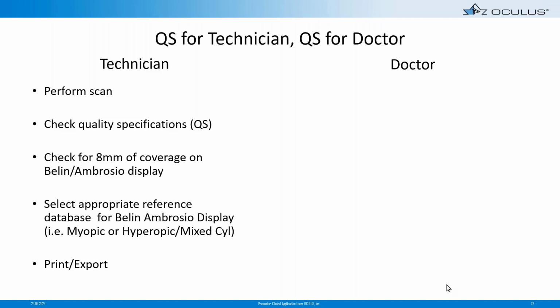I am going to put a disclaimer here. If a mistake is made, and the wrong reference database is selected, you can go back and redo it. It's not a one and done. You can go back and redo it if you need to.